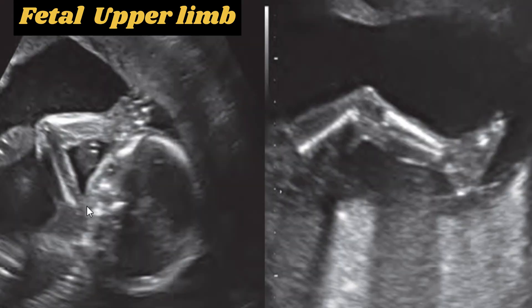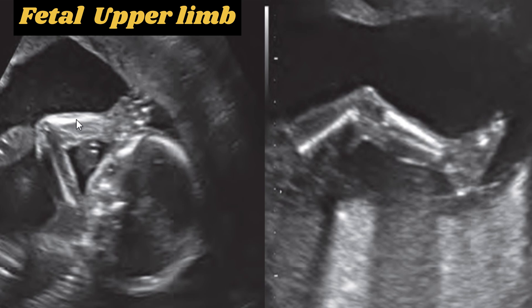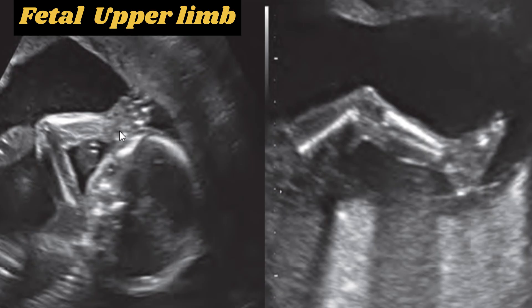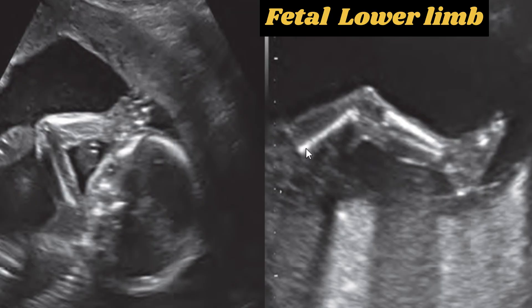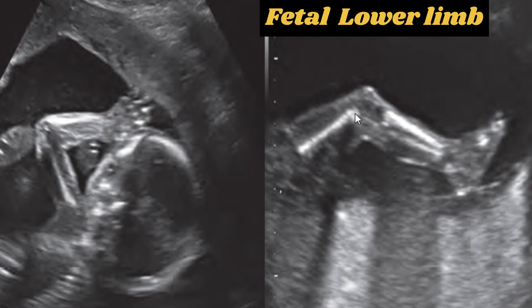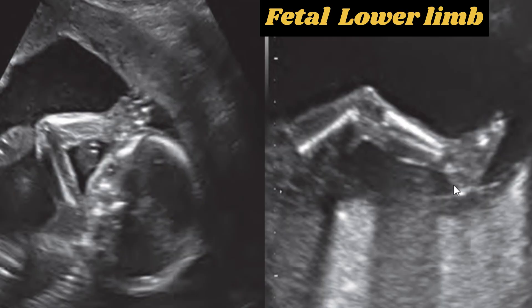Now we are going to discuss the upper and lower limbs of the fetus. In the sonogram, we can see the upper arm and forearm, with the radius and ulna of the fetus identified. The fetal hand is also visualized with its normal digits. The fetal lower leg shows the thigh, the echogenic femur, and the tibia and fibula in the lower leg, along with the fetal foot.